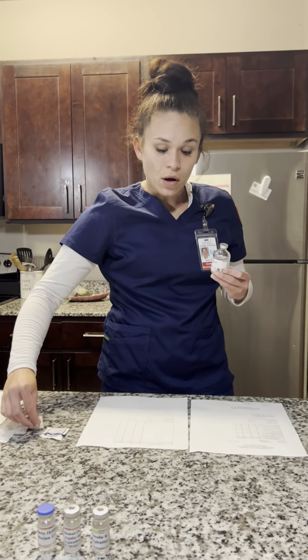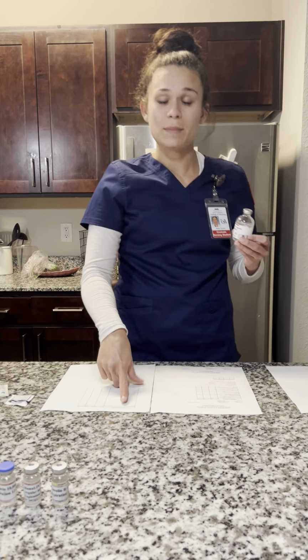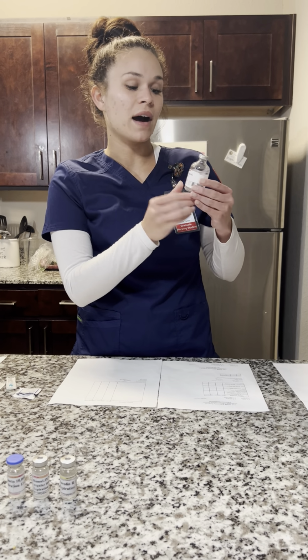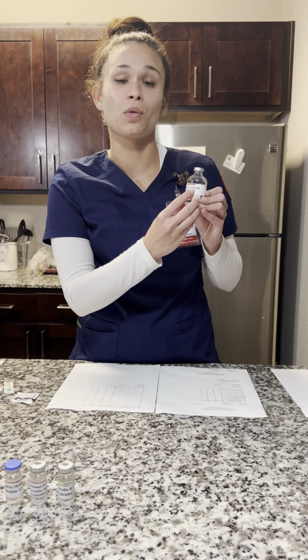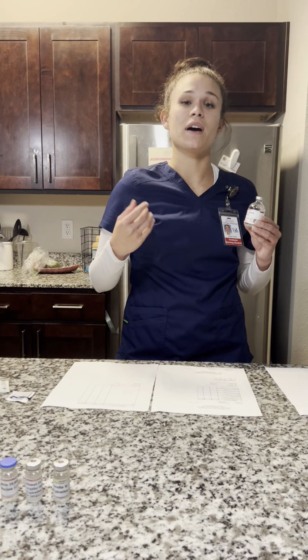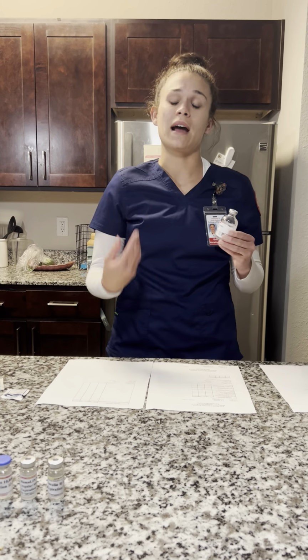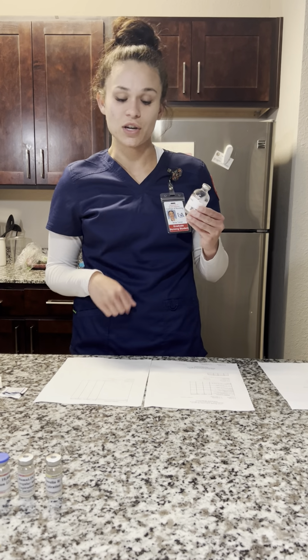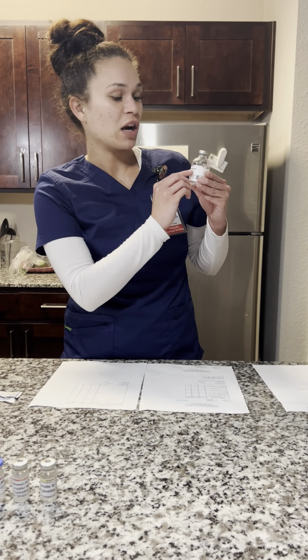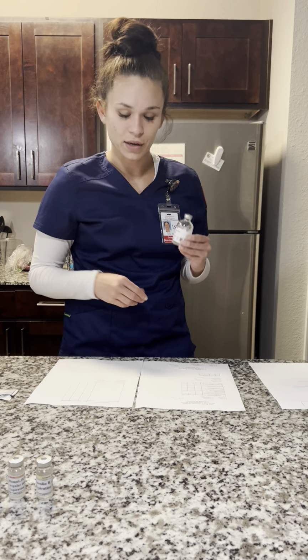Okay, and I'm also going to be checking the right dose, which is 5 milligrams, and I'm going to calculate how much I would need in my syringe. So my vial says there's 10 milligrams per 1 milliliter, and I need 5 milligrams, so that means I would need a half of a milliliter. I would have a colleague come and double check my calculations, and then I myself will double check my calculations. So 5 milligrams is what the MAR says, and there's 10 milligrams per 1 milliliter, so that means I would need 0.5 milliliters or a half of a milliliter.